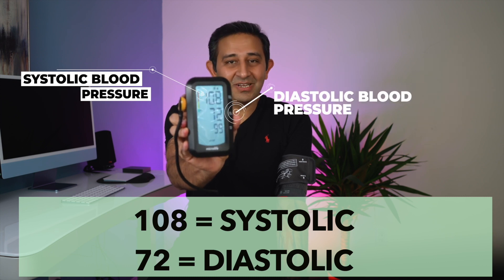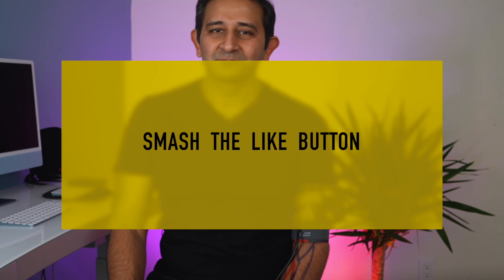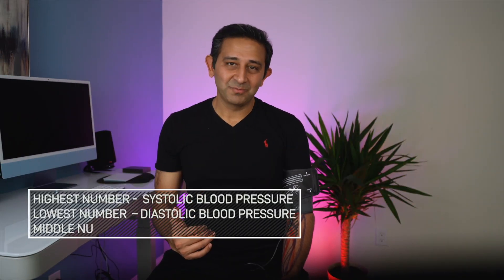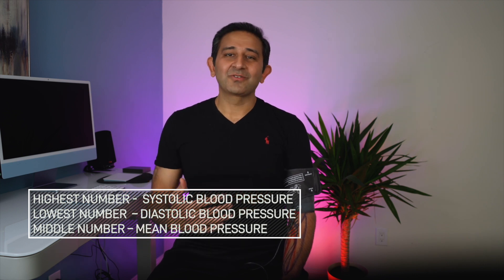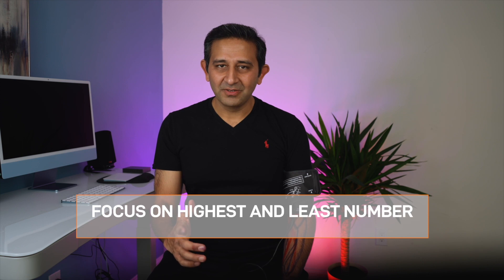Now you see three numbers. The top number is the systolic blood pressure, which indicates how much pressure your blood is exerting against your artery walls as your heart beats. The bottom number is the diastolic blood pressure, which tells you how much pressure your blood exerts when your heart is resting between beats. There's also a third number — the mean blood pressure — which doctors use in certain situations, but for home measurement, focus on the top two numbers. You can write down your numbers in a book or a smartphone app. If you're serious about blood pressure, measure at least three times and take an average.